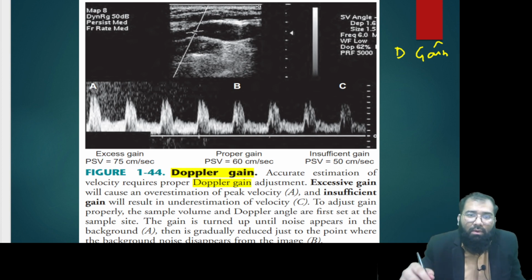Okay, let us see now. You look at this beautiful case here. So here, are you able to see that this is the ultrasound image and you are able to see this blood vessel? I'll trace it for you. So this is which image? This is grayscale image or B mode image. This is B mode image. Okay.